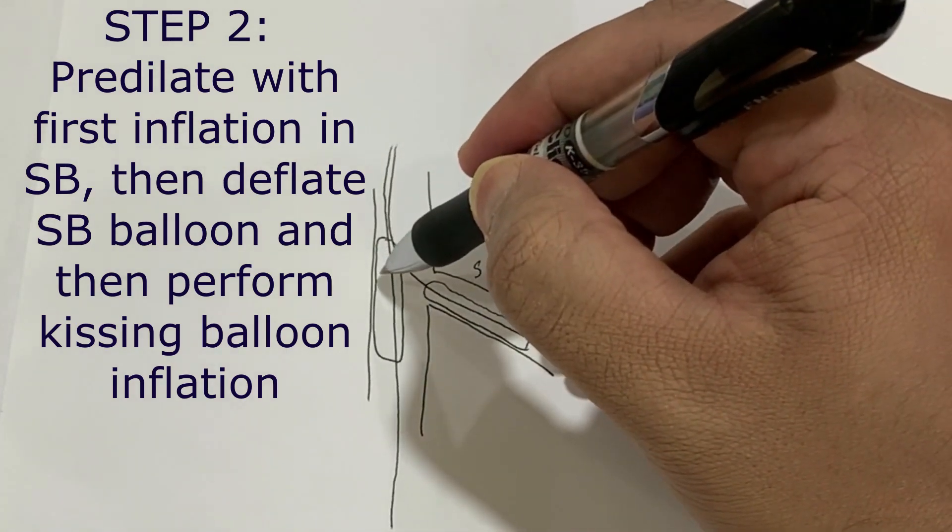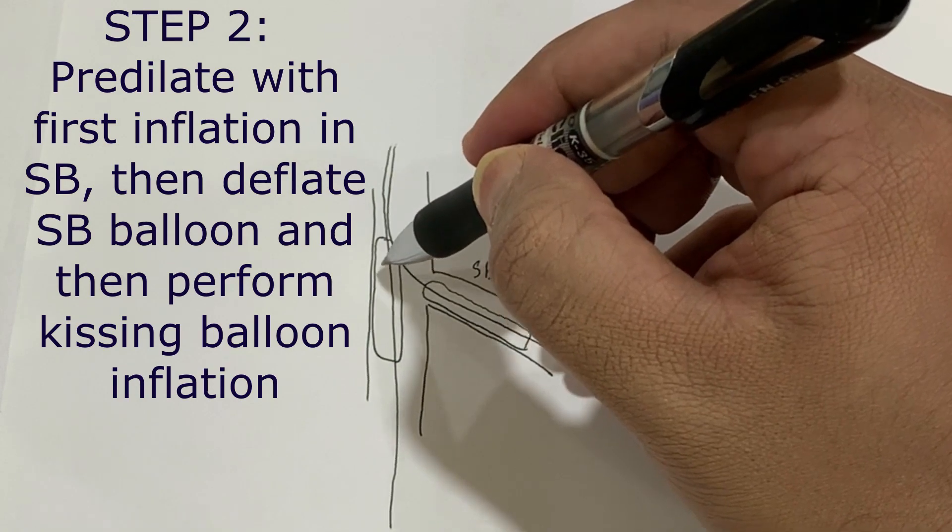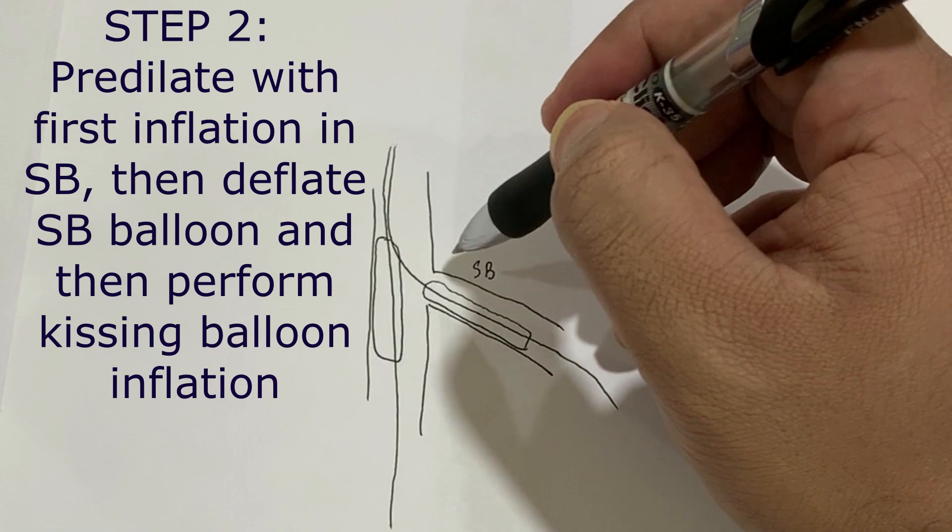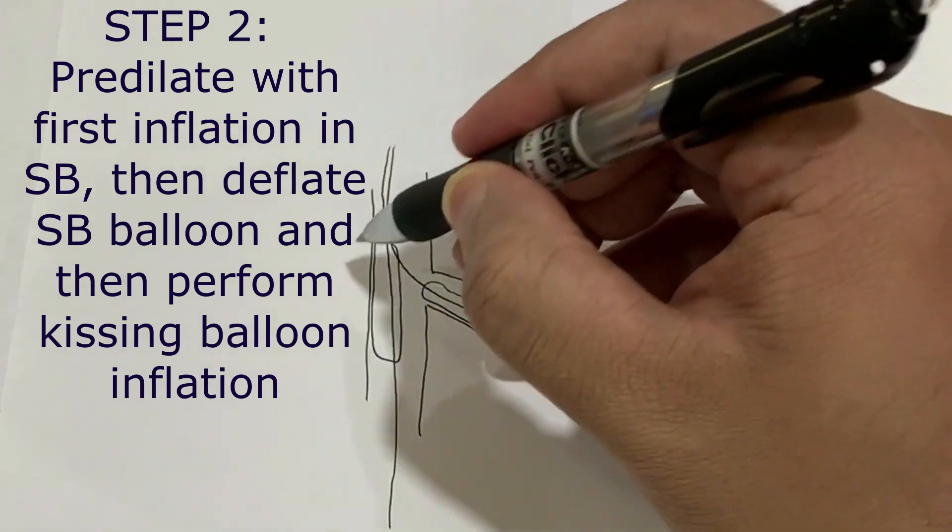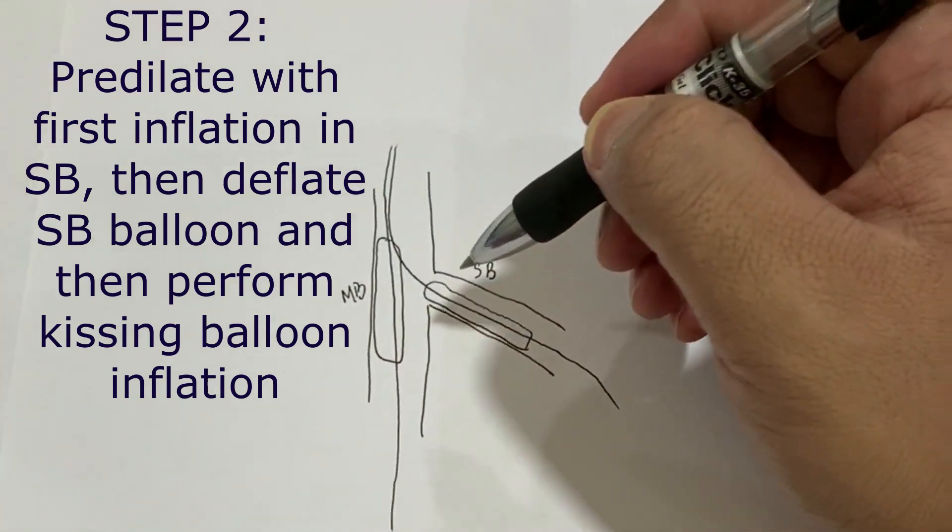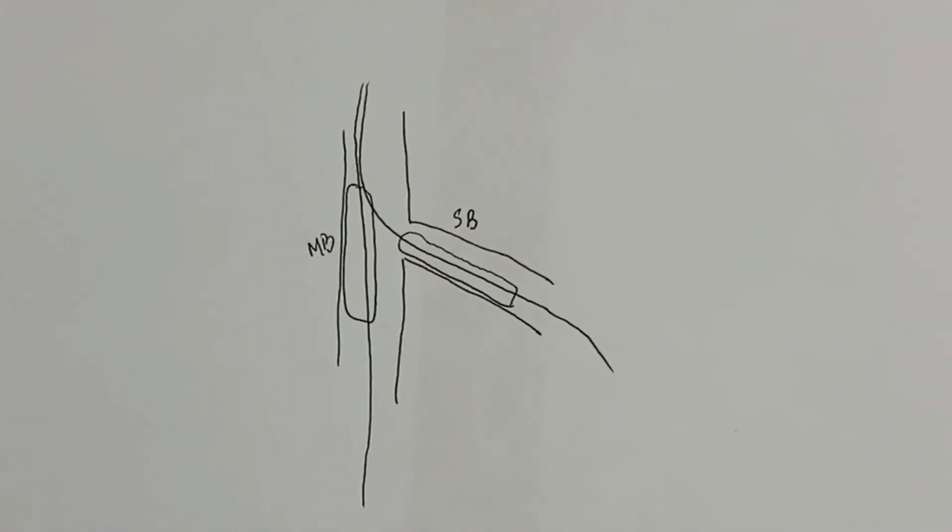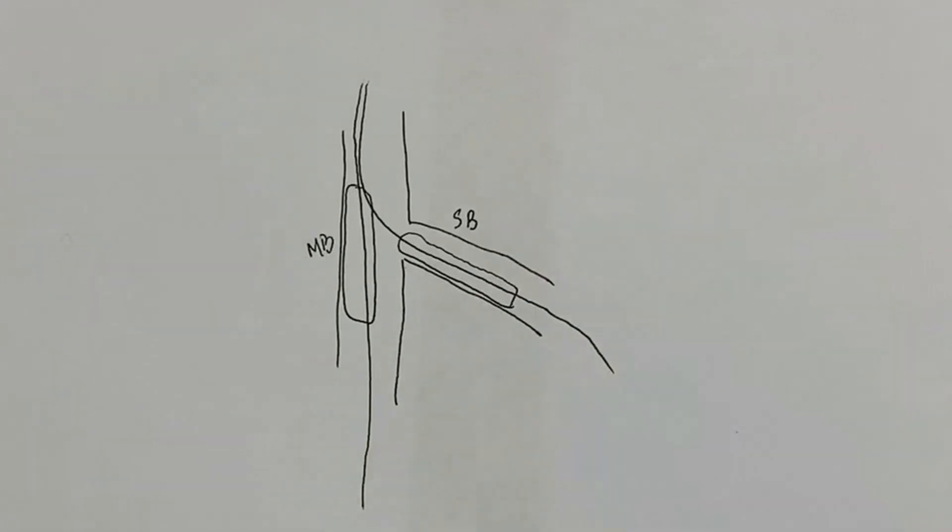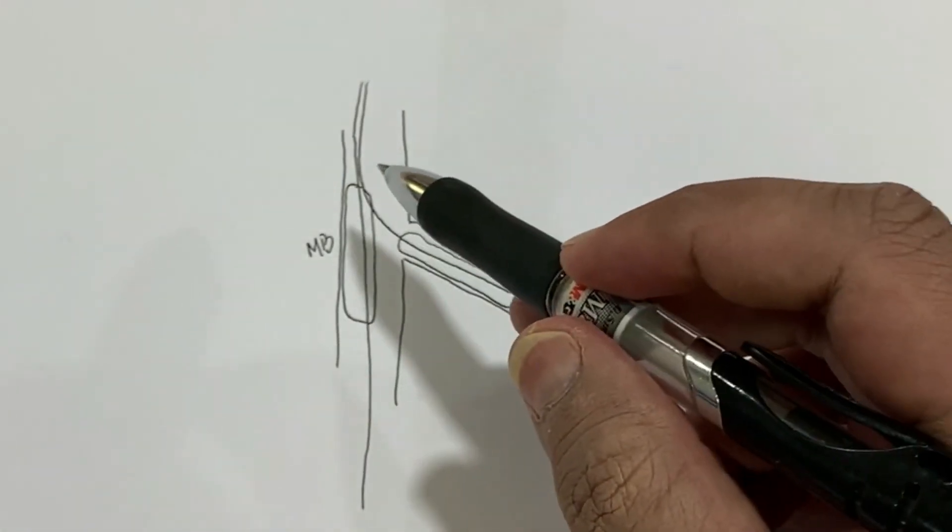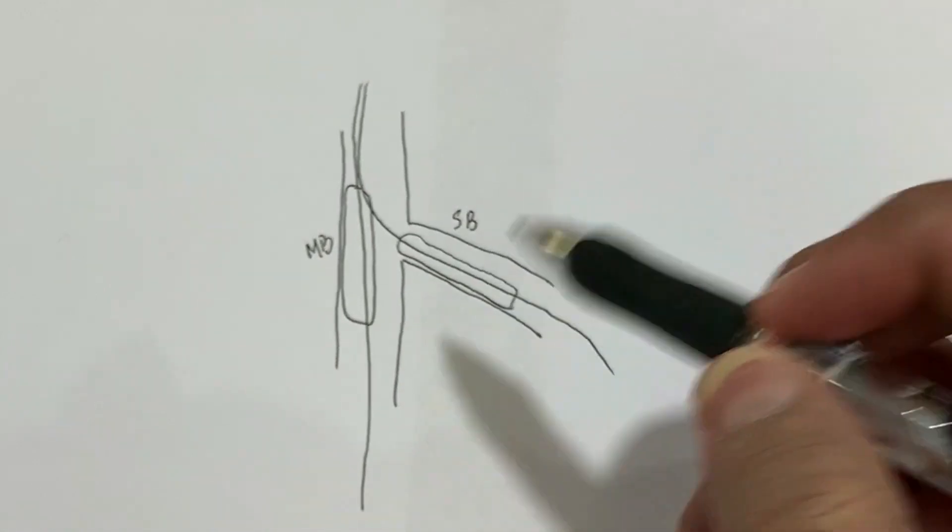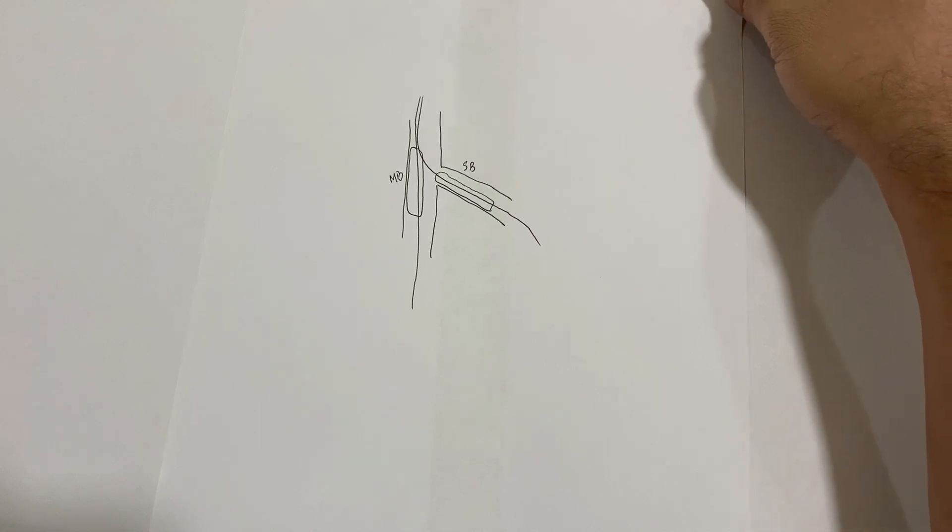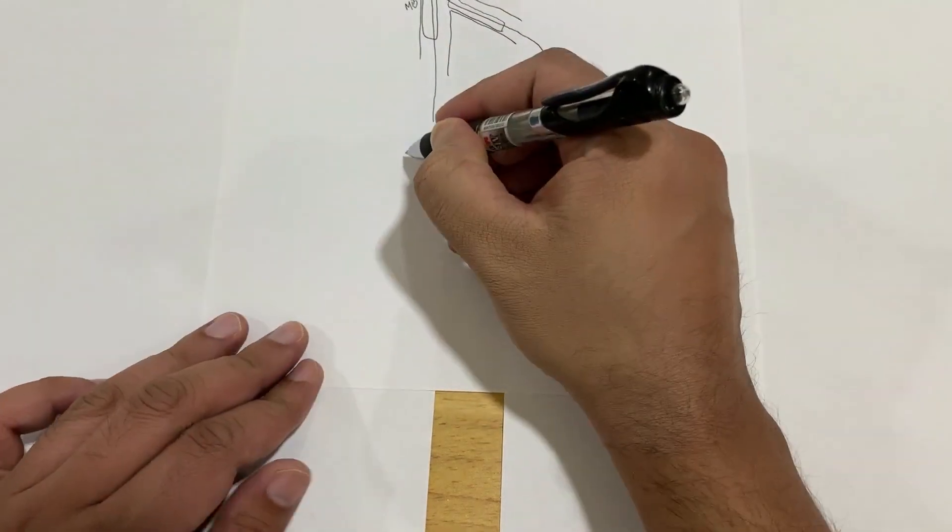Inflate this balloon, which is the side branch balloon first, and then inflate this balloon. After that, once both balloons are inflated, deflate and then re-inflate for first kissing balloon pre-dilatation. Pre-dilatation is extremely important. Pre-dilate first the side branch and then do the kissing balloon.